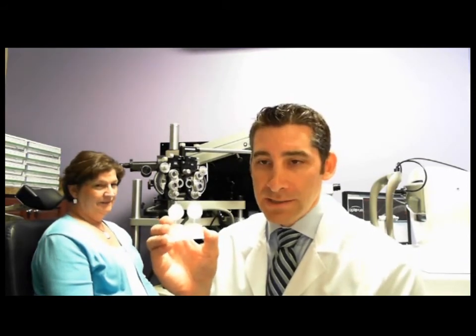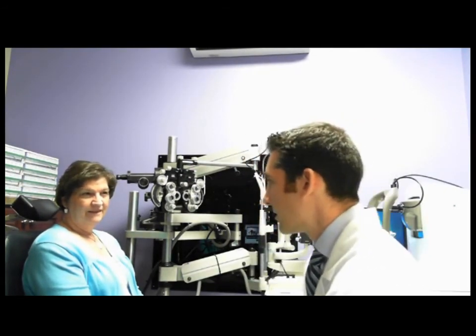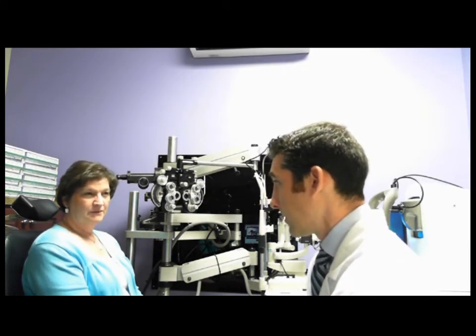You'll notice that the lenses arrive wet shipped, and that is going to be very, very important. When we put these lenses on, my guess is that they're going to wet a lot better than those trial lenses that we store dry. We've now allowed the lenses to sit for 25 minutes, and we are ready to inspect. But remember, the first thing I'm going to ask is, how do these lenses feel? Left one feels very good. Okay. Right still has an issue. Okay, so what that tells me is we're still probably bearing on that nasal portion of the cornea.